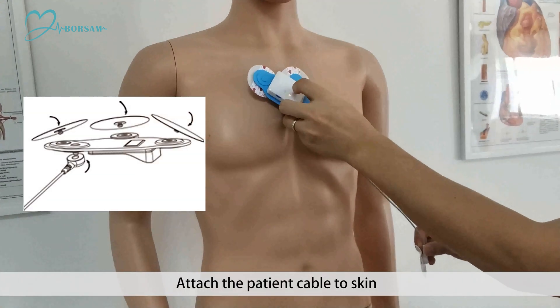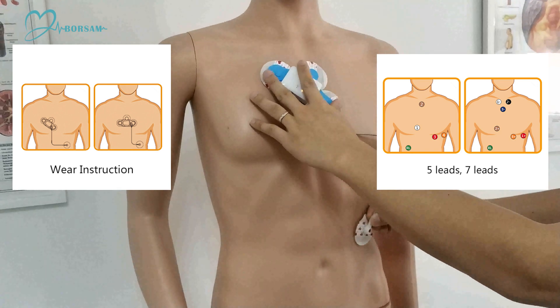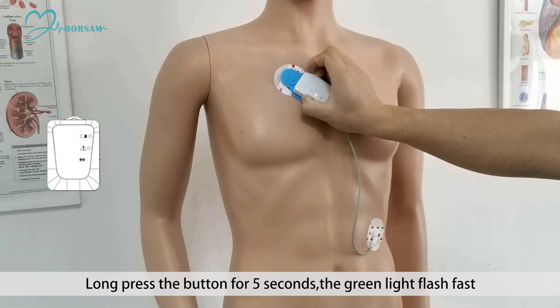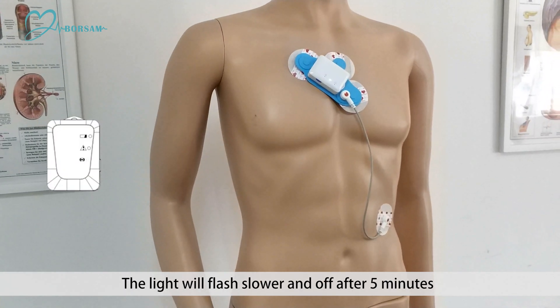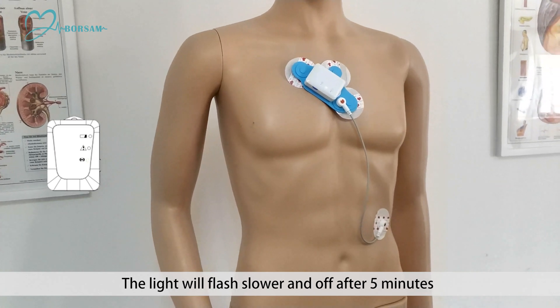Attach the patient cable to skin. Long press the button for 5 seconds. The green light flashes fast, which means the ECG recording starts. The light will flash slower and end off after 5 minutes.